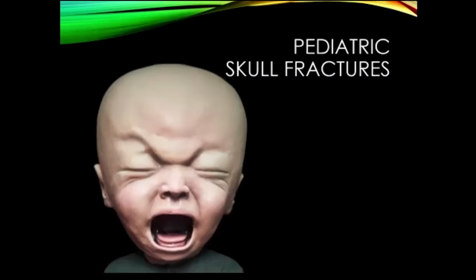And most of the time, people will say, well, we need the head CT to look for the underlying trauma. But some folks are using this for difficult delivery. They come out of the birth canal, and do they have a skull fracture? Because they might get a very large hematoma. So it might be nice to know that in advance.